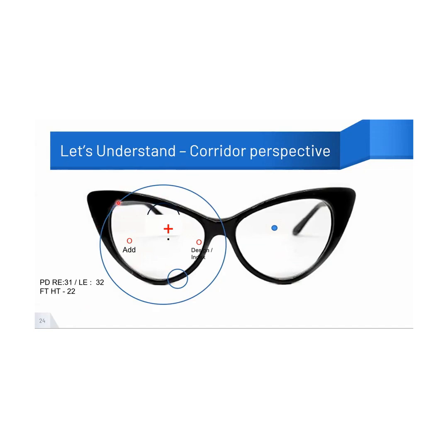Okay. You can see here, first thing is you will need a bigger diameter. Like when you see here, it is almost at the edge, right? Because the size is so huge, this PD, maybe you will need a bigger diameter. Number two, what you can see is the reading zone here is cut. Okay, you only get hardly about 20 to 30% of the reading zone. Distance is compromised because what you see is from the fitting cross till the top where the distance is marked. This is generally going to be about 6 to 8 mm, but you see that there is a very minimum zone that the person gets.